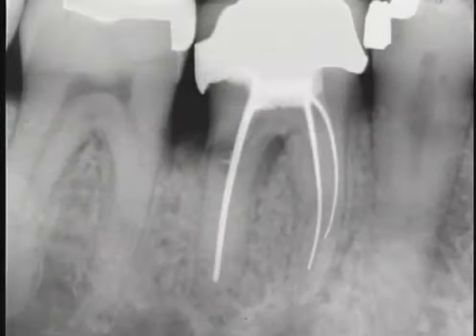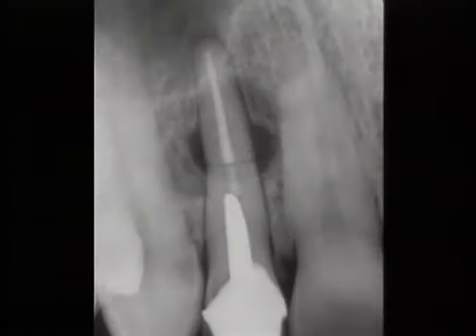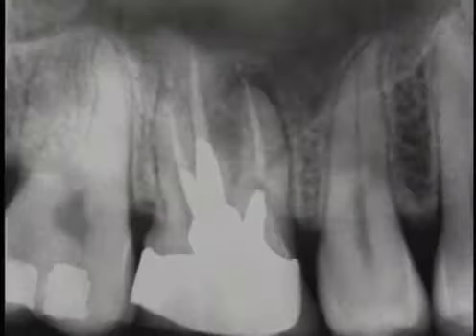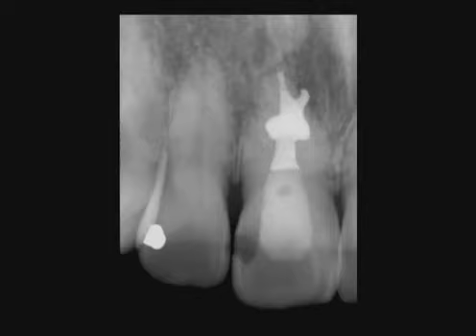Many significant advantages result when failing endodontic cases are non-surgically retreated. Disassembled teeth can be evaluated for mechanical failures, micro-leakage, fractures, missed canals, pathologic and iatrogenic problems, and importantly, these root canal systems can be recleaned, reshaped, and repacked in 3 dimensions. In fact, most endodontically treated teeth that exhibit post-treatment disease can be successfully retreated non-surgically.